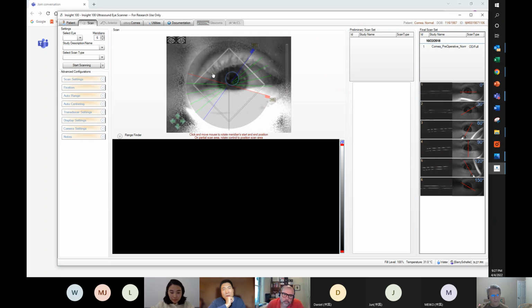But now you won't have any image of the cornea up here. But you can try to move it around a little bit to get the scans you really want to get, okay? So it's just a couple tips. I'm sure in future training sessions, we'll begin to start optimizing scans, what we need to do there, okay? I wanted to at least show that.